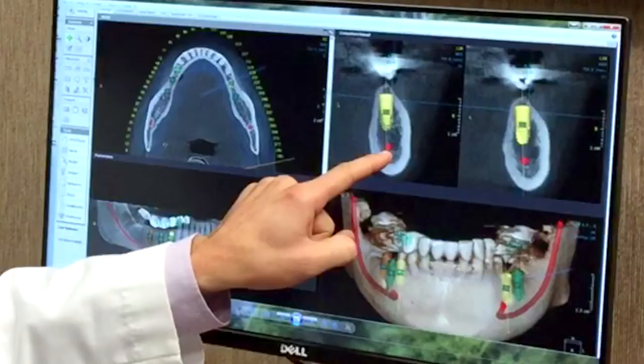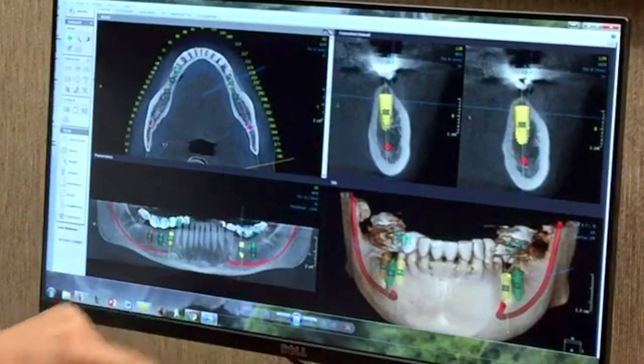This red dot here in this view, red line in this view — that is your nerve that you do not want to run into with the implant. Hitting that nerve can cause paresthesia, which will make it so you could be tingly or numb in that area. So we definitely don't want to get near that.